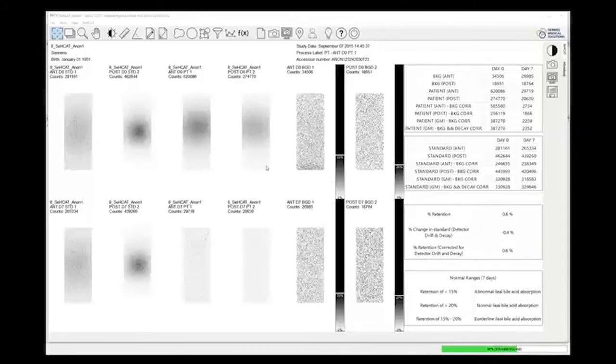But yeah, I mean, it's going to be sort of a game changer, really, isn't it? I think that it's so nice to have it actually as part of the processing suite rather than as a macro. And it is just so easy to use. It's going to be lovely for people to finally retire those spreadsheets.